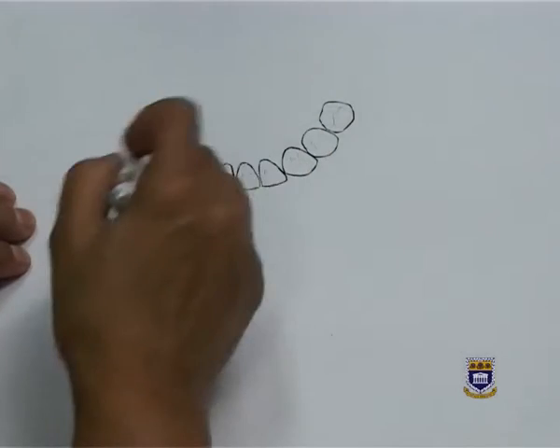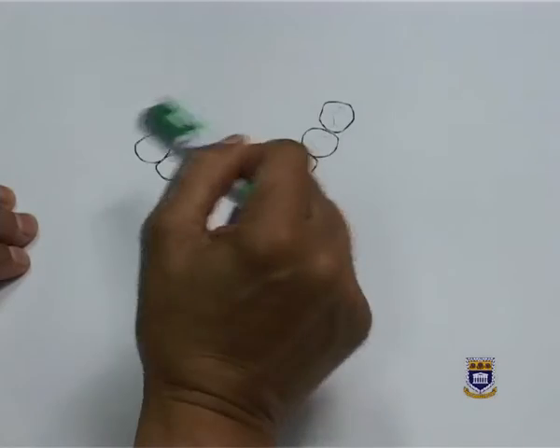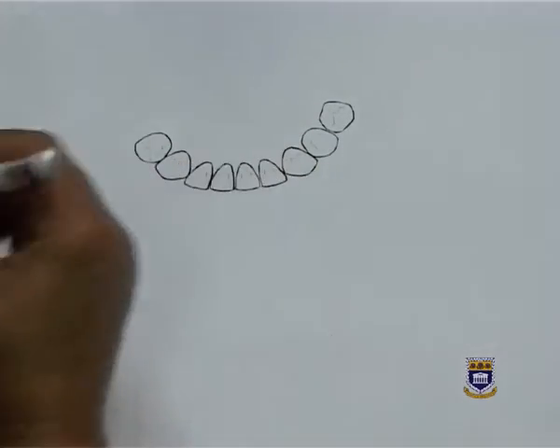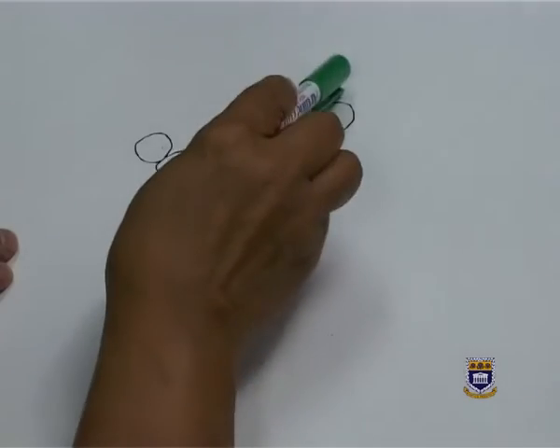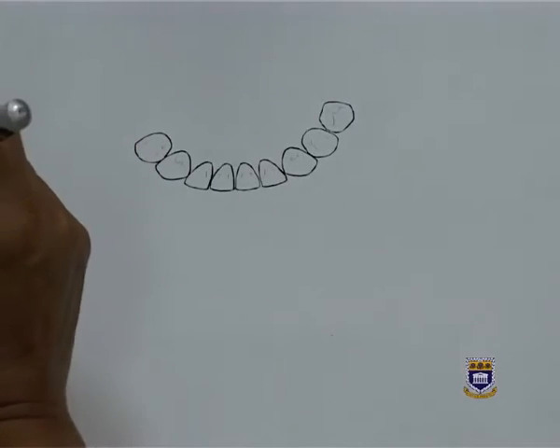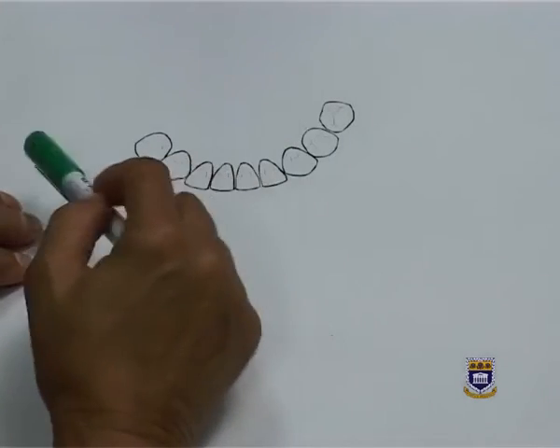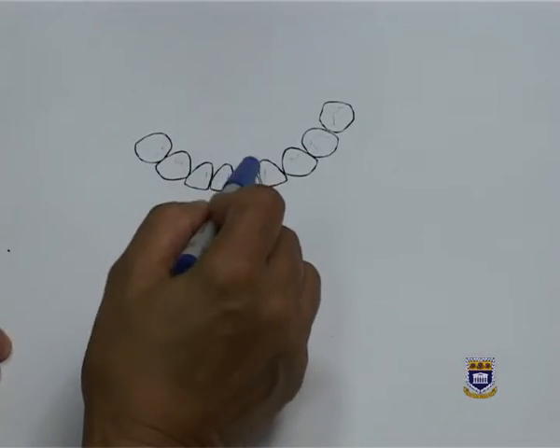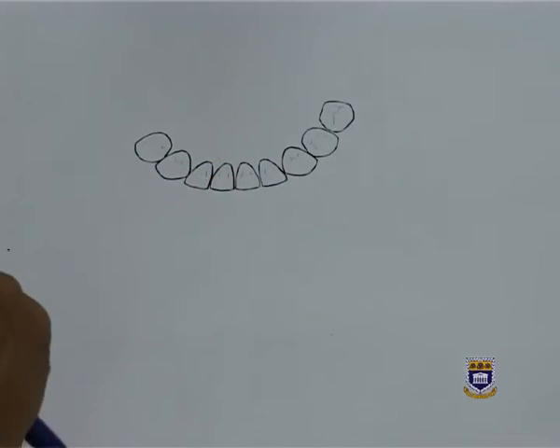And the major challenge is the difference between the displacement of the tooth and the mucosa. And in our design, we'll have to look at that. Clinically, we're going to have to examine the tissues quite clearly, look at the support that the ridge brings before we design our denture. We also have a choice of acrylic, of a lingual plate or a lingual bar. And a bar is always the first choice, provided that I have 7 millimeters of space between the gingival margin of the teeth and the lingual frenum in the floor of the mouth.